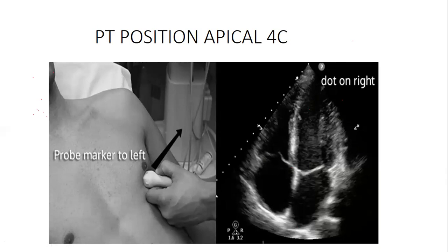This patient, it was a lazy echo. We call it lazy echo. If you see, the hand is not even raised. You see a lot of people doing echoes like this, and they justify why they do this, but if you want to optimize images, please do the correct thing. So this patient was in supine, or maybe slightly. The other thing, we don't know the condition of this patient. Remember, I mentioned some patients are unable to do the standard things, but this patient was in supine, as you can see, not in the left lateral decubitus.